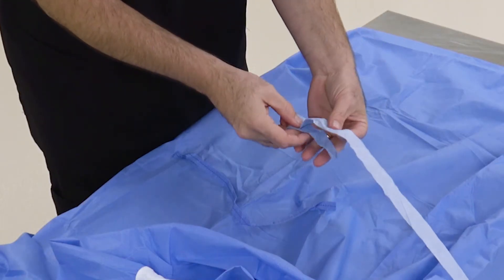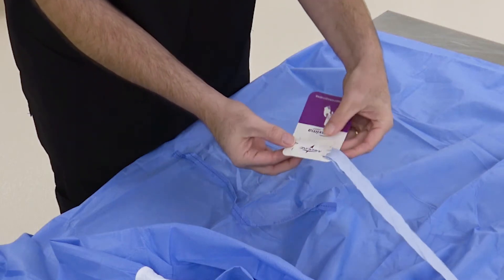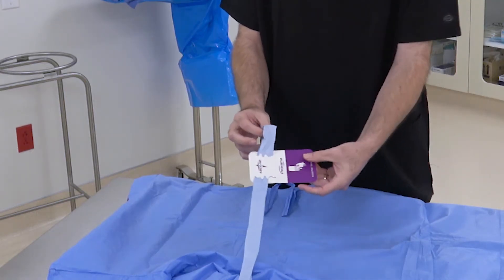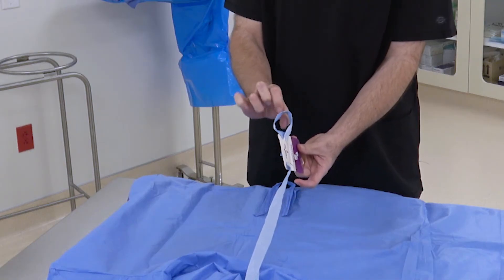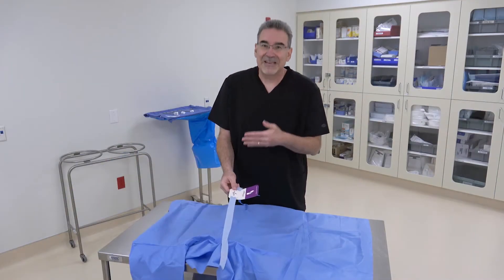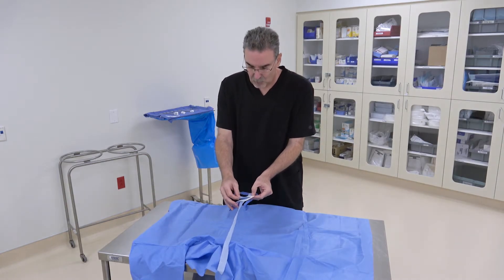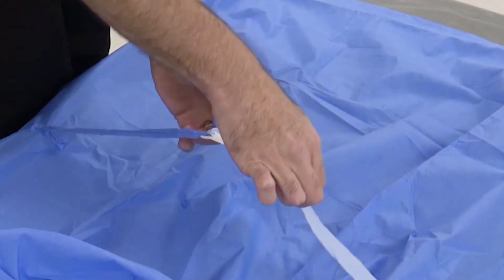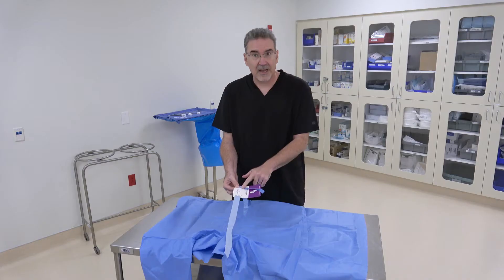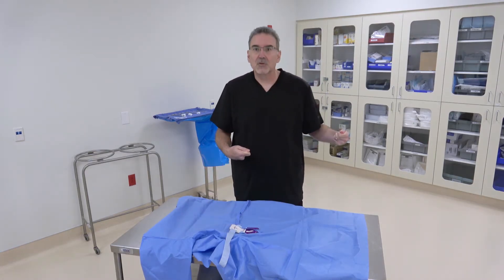Take the long tie and fold it over slightly to make a little fold, then feed it through the card twice — go in from the top on that side, pull it under, and feed it through to the other side. Now we have a little loop. Take the short tie and stick it into that loop. Pull the one piece nice and tight, and that loop tightens around the short tie. Lay it down in the center so you can grab the card and pull the short tie out easily.